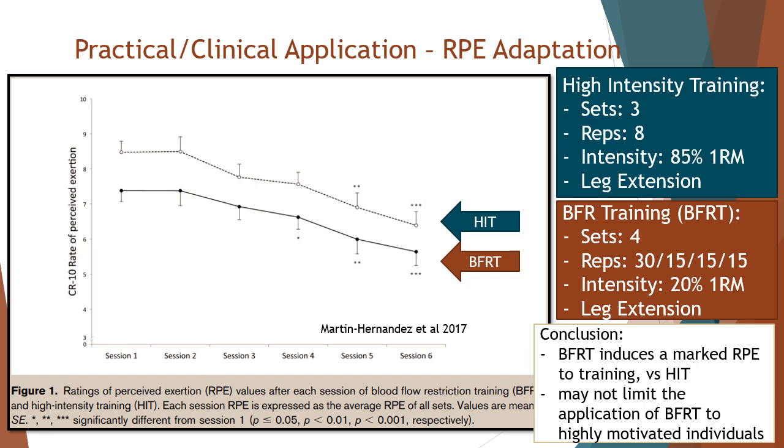Okay, so what can you expect from someone's RPE with BFR? This study, I kind of like it from a practical application standpoint, and I'll educate patients on this. With high intensity resistance training, and I use the example of a spin class or a boot camp, if the patient had ever taken that, it's going to be comparable to that with your BFR training the first time. You're going to be right around an 8 out of 10.